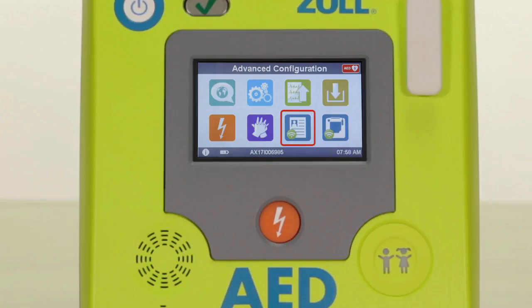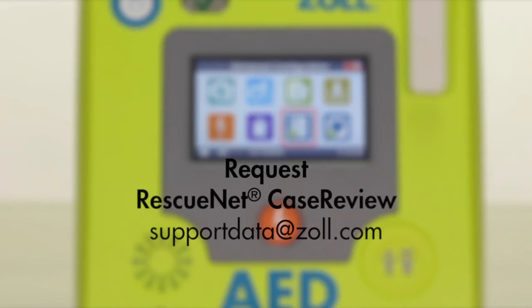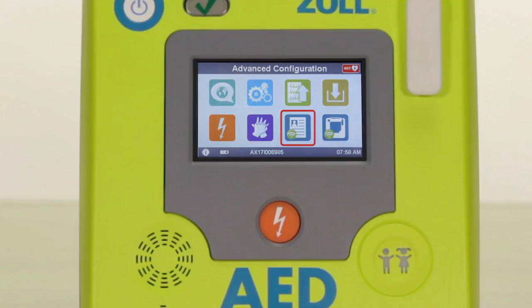The blue report icon with the green Wi-Fi waves icon is where you set up your Wi-Fi connection for transmission to ZOLL Case Review, should you wish to access case data such as ECG and CPR performance. Note that you will need a Case Review account to do this. ZOLL offers Case Review Basic free of charge for AED 3 users. You can request a free Case Review Basic account by contacting ZOLL support at supportdata@zoll.com.